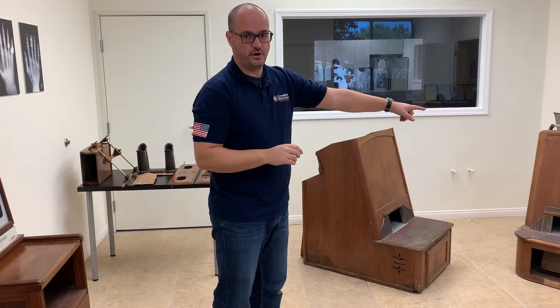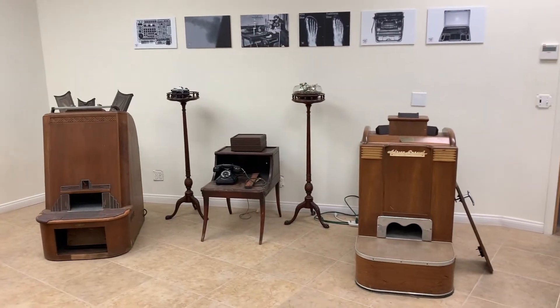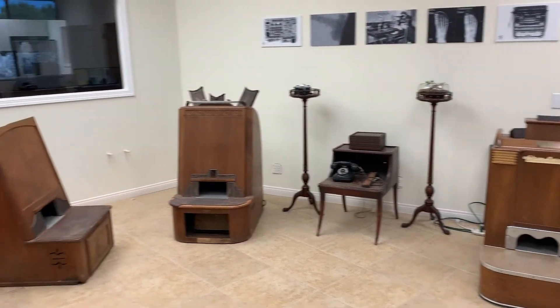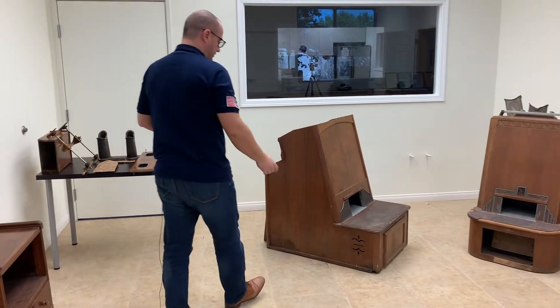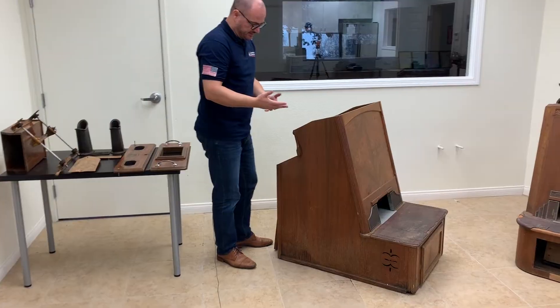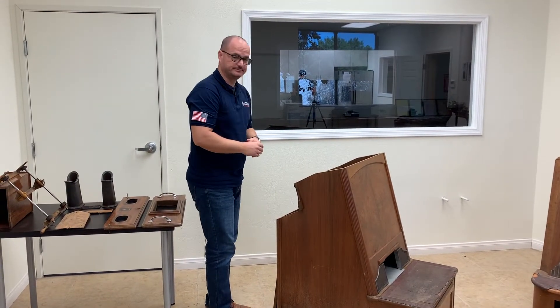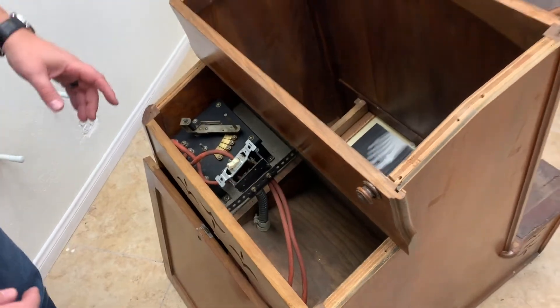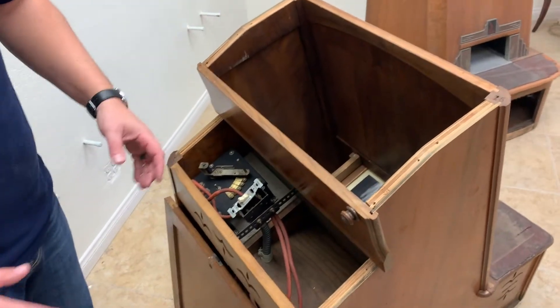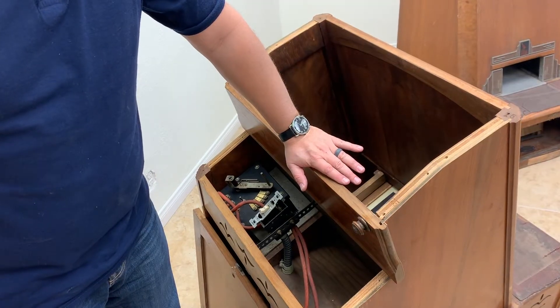As you can see here, we have a couple of other models of the Adrian Special — one from the 20s, one from the teens. This is one unit we just received and what we decided to do is just to take it apart to show you how to use it. What we've done here is remove the top of the unit.